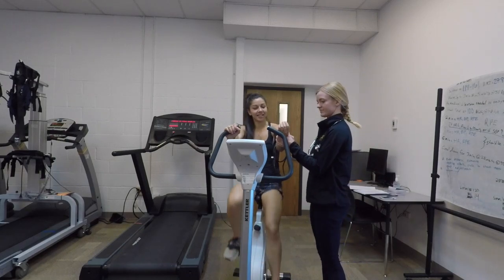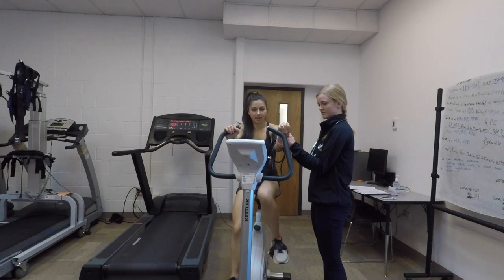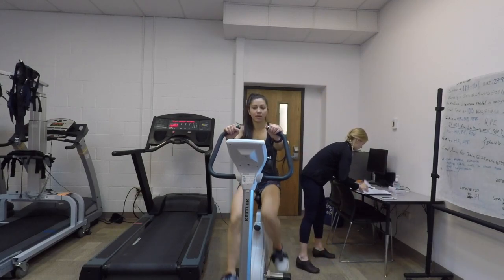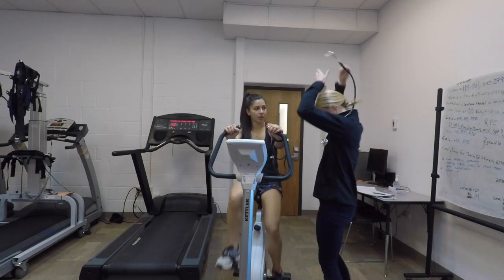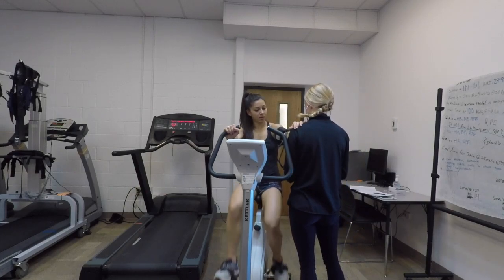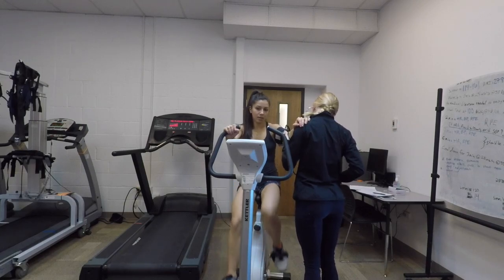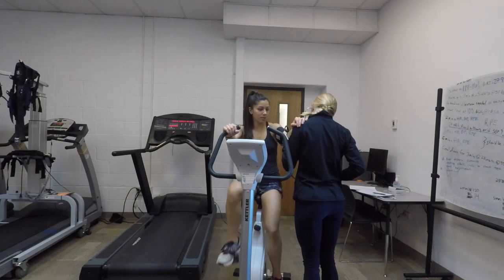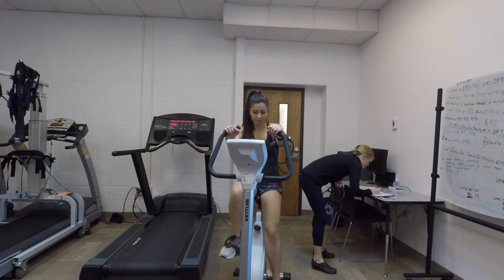Okay, so let me go ahead and take your heart rate again. Okay. At minute 2, your heart rate was 122 beats per minute. Now let me go ahead and take the blood pressure again. Okay, I'm going to have you do the same thing. Put your hand on my shoulder. I'm going to stabilize your elbow. Here we go. Very good. And that was 128 over 72.